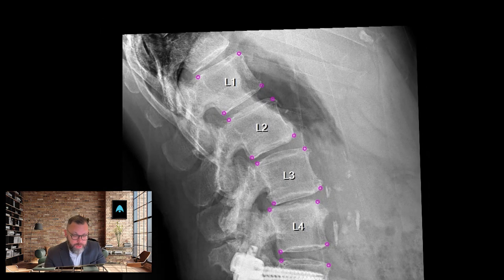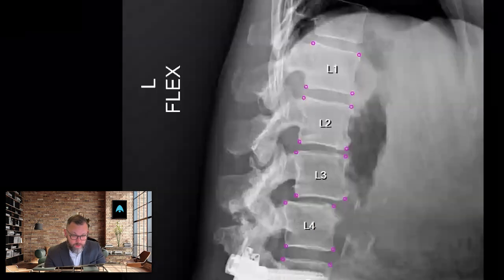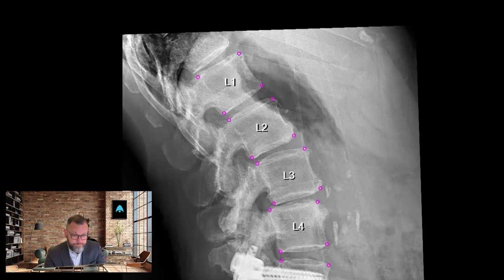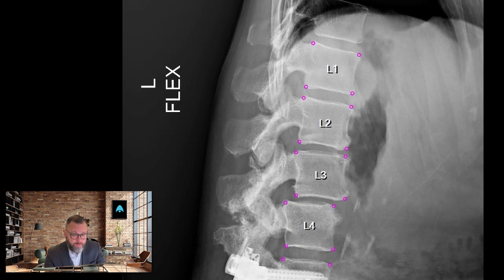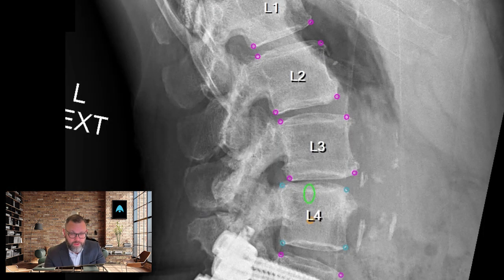And SpineCAMP, right over the surgical hardware, it sees through it. So it gives us accurate geometry. And we can see that even at the L5, S1 level down here, we are getting a little bit of motion. So there's a little bit of a pseudoarthrosis in here. But in terms of chiropractic and rehabilitation, this is my primary area that I'm thinking. So let's go to the report.